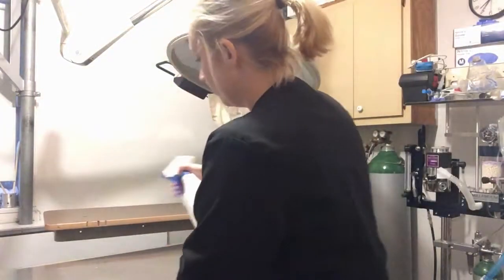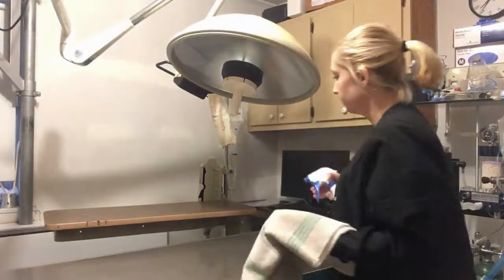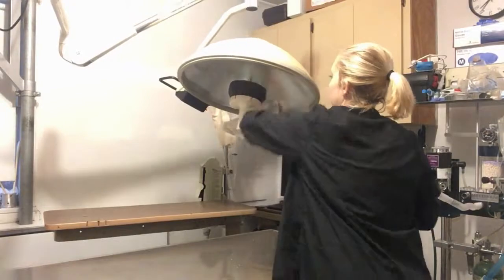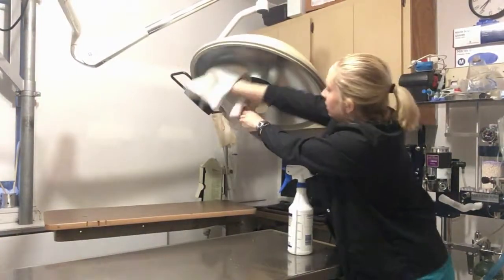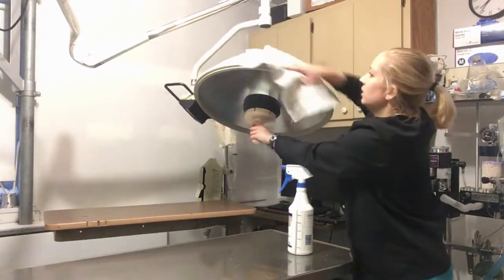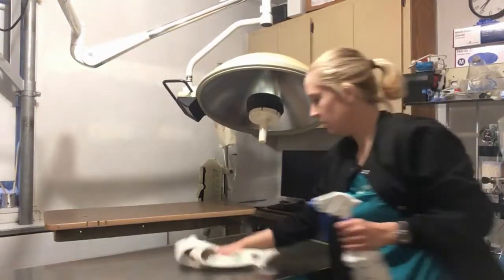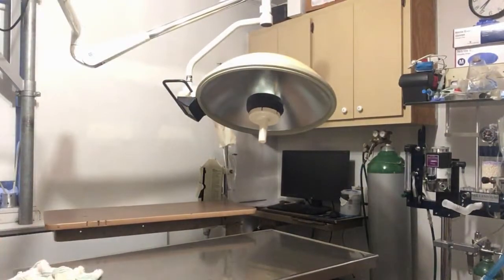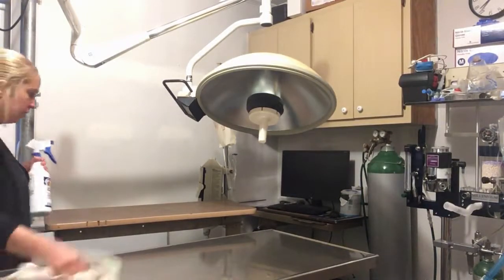So really cleaning off and disinfecting the surgery table, lights, all surfaces, and any tables that were used during your surgical procedure.